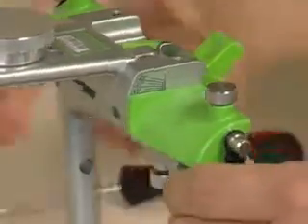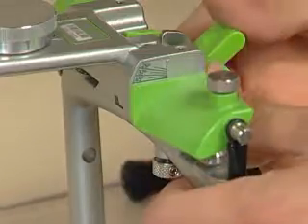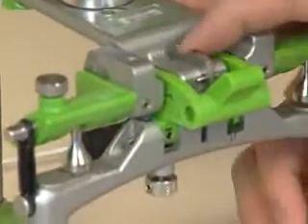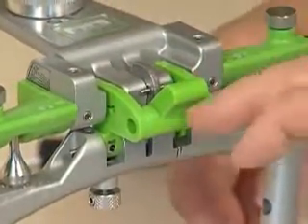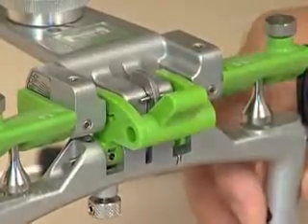And as I said earlier, we put the analogues at 45 in order to create a situation so that when we mount the lower model, it tends to hold the condyles in centric. We want to make sure the centric lock is in place, which centers the top of the articulator over the lower, and then the centric latch is in place that holds the top of the articulator against the condyle balls.